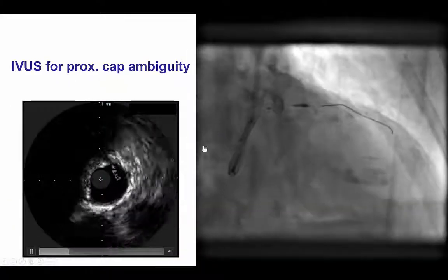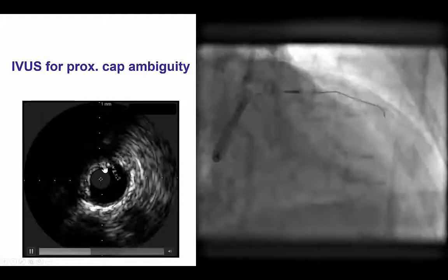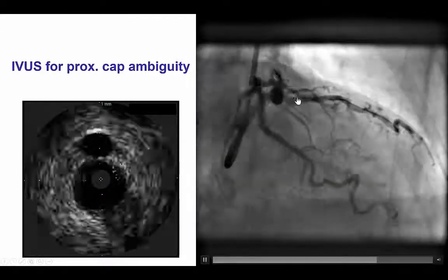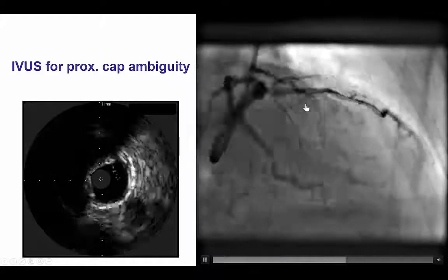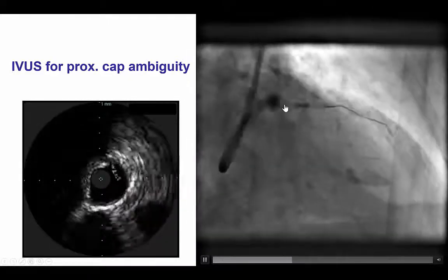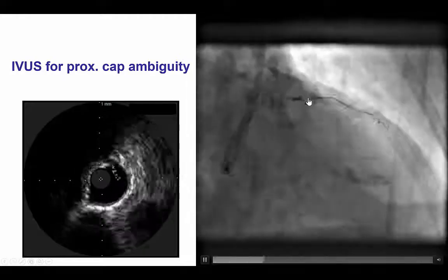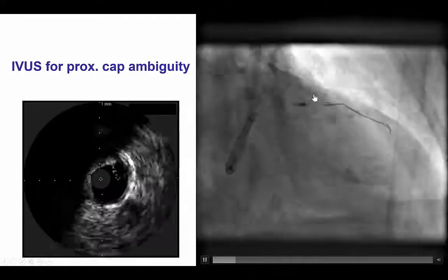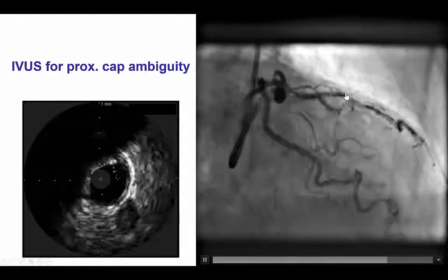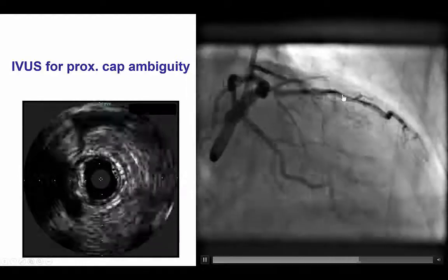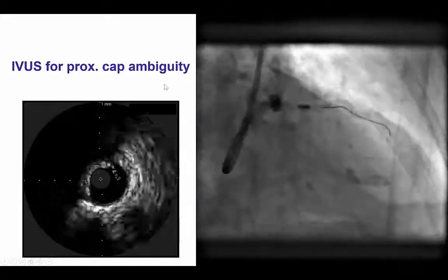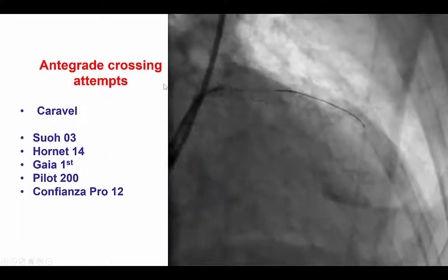Intravascular ultrasound demonstrated that the ostium of the occlusion was highly calcified and was right proximal to the takeoff of this large diagonal branch. However, there was really no nub or entry point, and there was a smooth transition between the proximal LAD and this diagonal branch. The challenge here was that there was no entry point into the occlusion, although we did understand where the occlusion was.